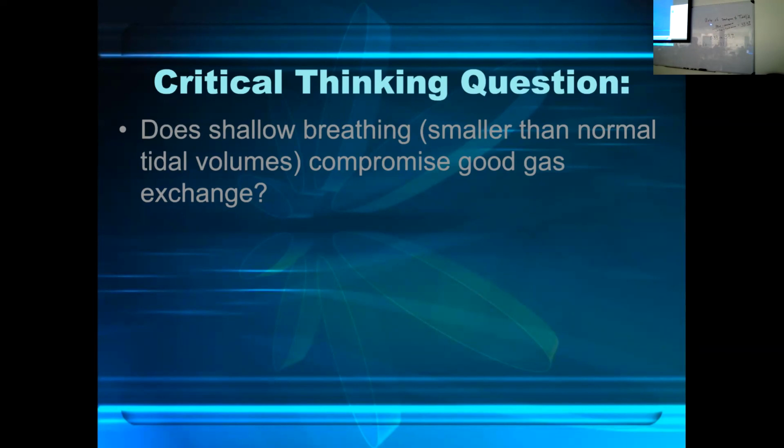Would that increase the ratio of dead space to tidal volume? Yes. Very good. So small tidal volume, it's going to have that higher percentage of the ratio of dead space to tidal volume. Good application. Chris, you had a question? I was just going to say, it would increase the ratio. Oh, okay. Yes, very good. So less alveolar ventilation, you're going to have a higher dead space to tidal volume ratio. Bottom line is the tidal volume is too small for your patient.